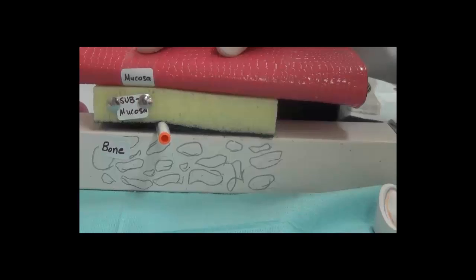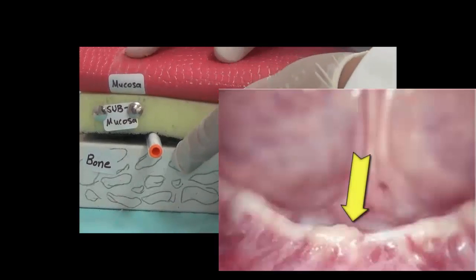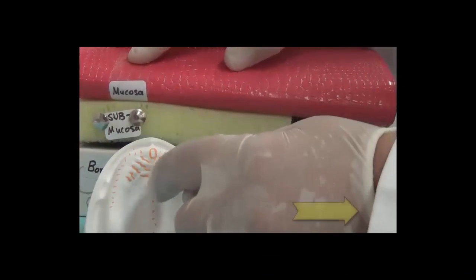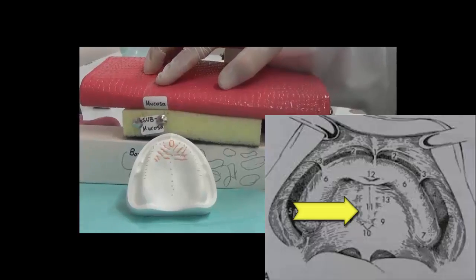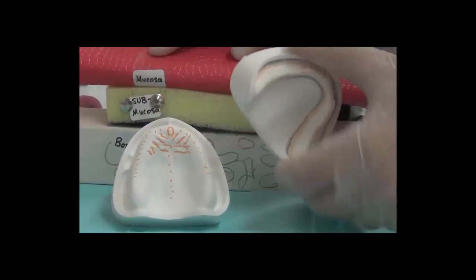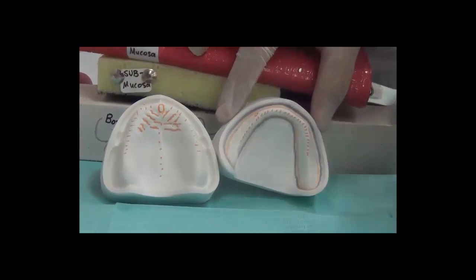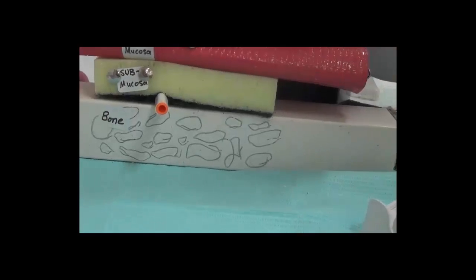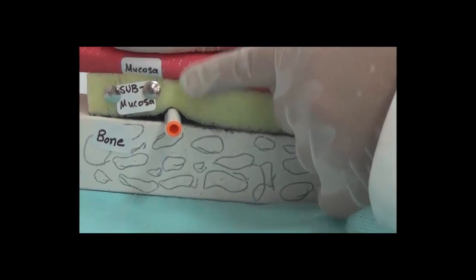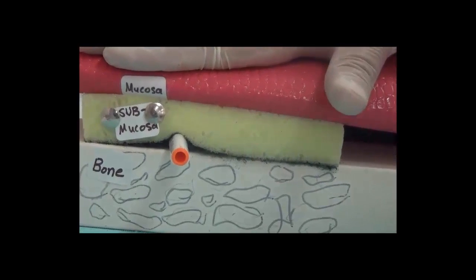The third reason sometimes why we need to relieve an area is the presence of bone spicules. These sharp bone spicules can be present in the form of the mid-palatine raphe. Underneath it we have the bone where the suture had closed, and that bone is projecting. And in the lower, that can be in the areas where we have a knife edge ridge. So if this sharp bone spicule is present and the mucosa is pressed, the mucosa overlying it will be traumatized by this bony spicule. So those are also areas that need to be relieved.